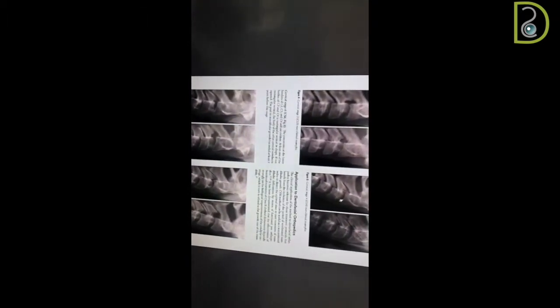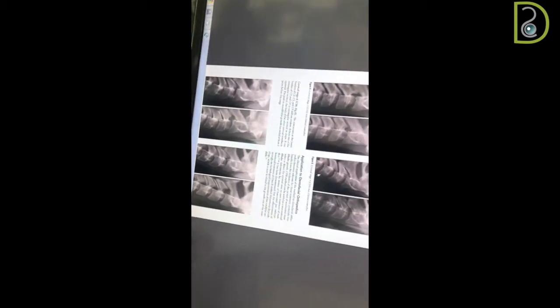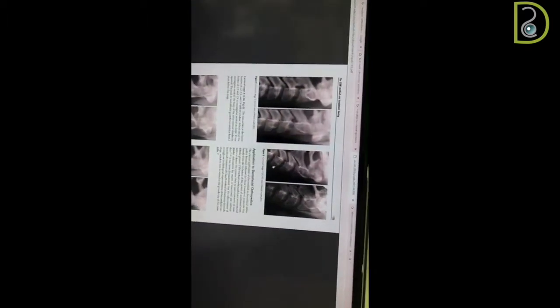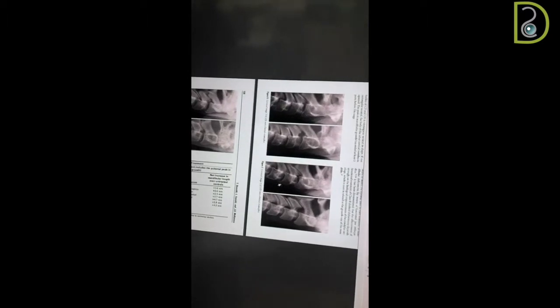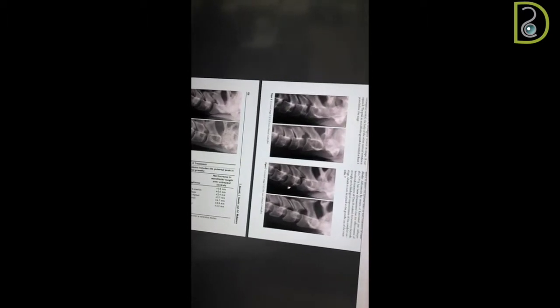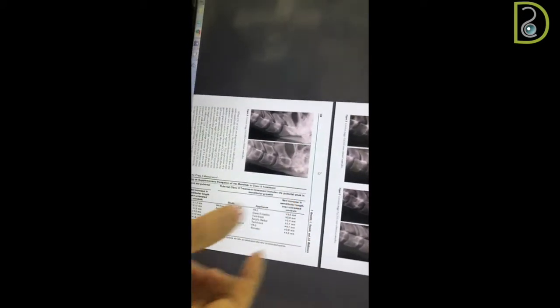Stage 4, concavity is there in 2, 3, and 4, and it's not too long. The vertical part of the vertebrae is not too long. Stage 5, this becomes long and now it's like a square. And stage 6, it's vertical rectangular, it became long, so it's rectangular in this shape, not this shape.